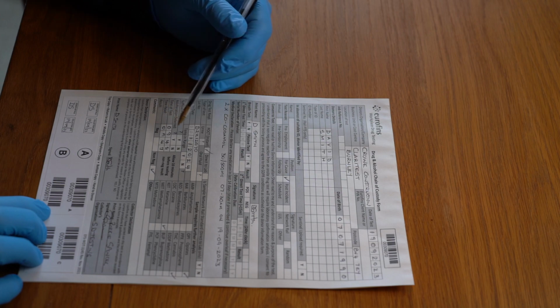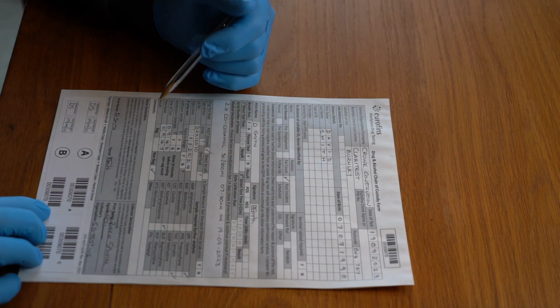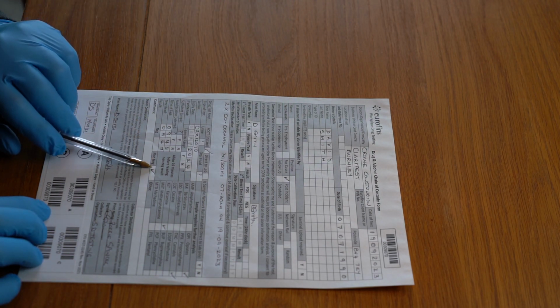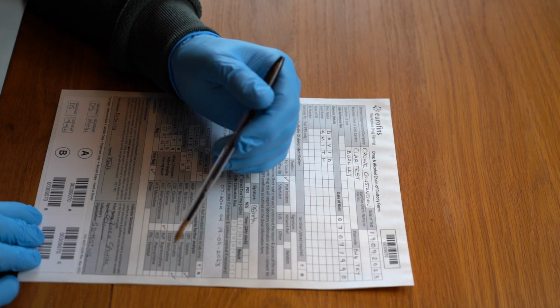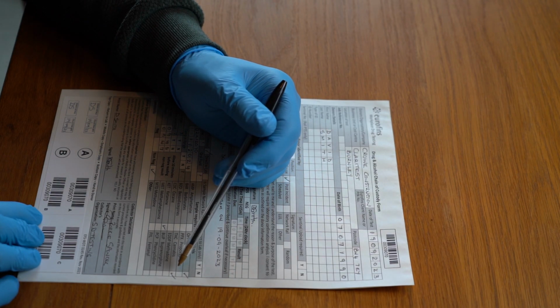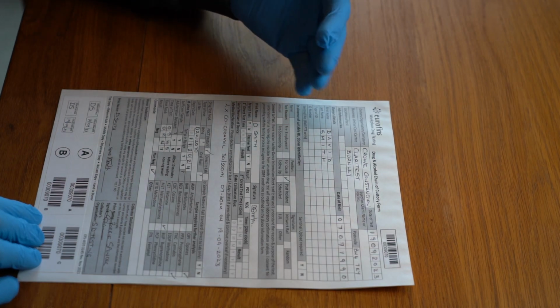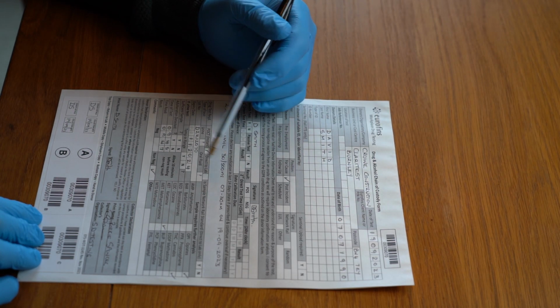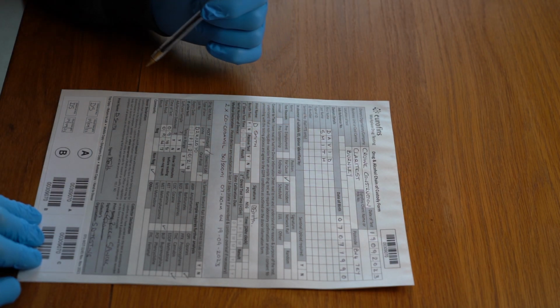Underneath that, you'll need to say what the result of this test was, negative or non-negative? You would only be moving to a chain of custody test if it was a non-negative result, so I ticked non-negative here. And this person had failed the initial test for 3 drugs, ketamine, cannabis, and opioids. The opioid, I suggest, would be because they'd taken cocodamol that morning, but apart from prescribed medication, it also failed for 2 of the illegal drug groups.